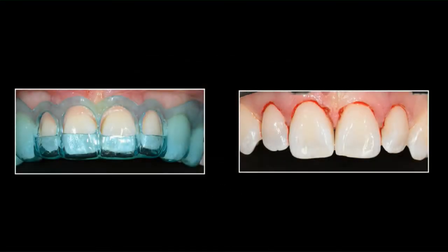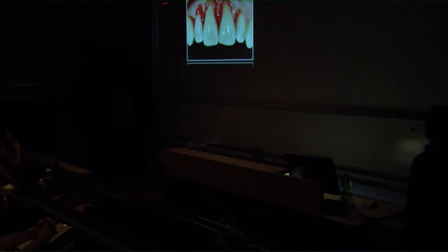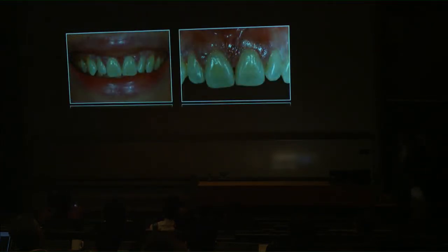So these are some pictures from the surgery, the surgical guide in place. After soft tissue reduction, the bone reduction is now completed, and suturing. And this is Josephine about a week later. You see that we lost a little bit of papilla height in the central.